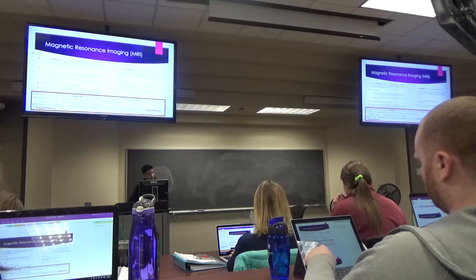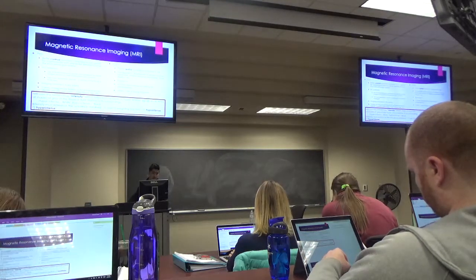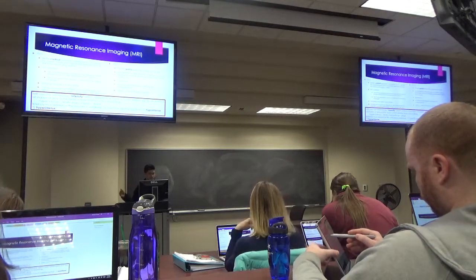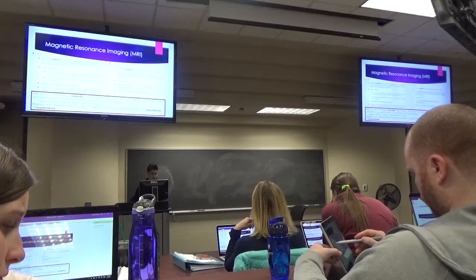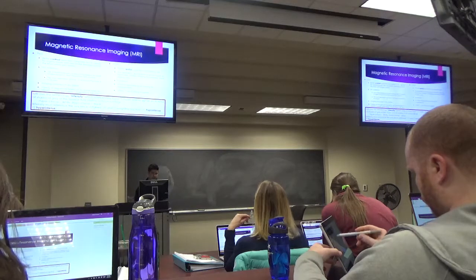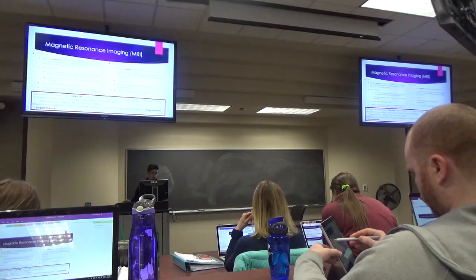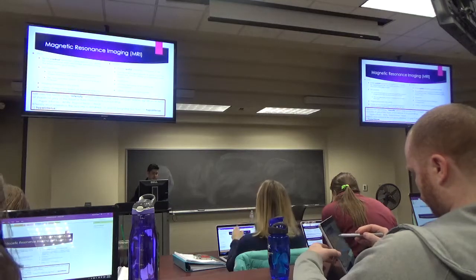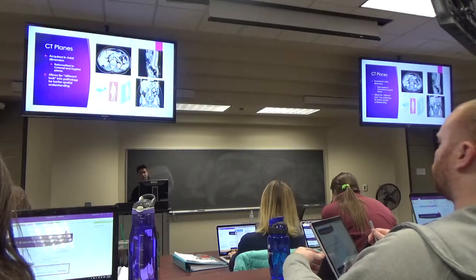Another pro is that there's no radiation. The reason why is because it uses radio frequency pulses and gradients to obtain images based on their interaction with the proton. So in short, we basically use RF pulses or waves that the MRI produces. It gets shot over to the patient, and it interacts with the protons. When I'm talking about protons, we're talking about basically hydrogen, and hydrogen is the most abundant source in the body because hydrogen basically is water. So we're just evaluating more or less how much hydrogen or water each tissue contains that we're trying to evaluate specifically. The good thing about MRI also is that imaging can be obtained in any single plane. So here with CT, it has to be axial, then you have to tell the computer to reformat it.